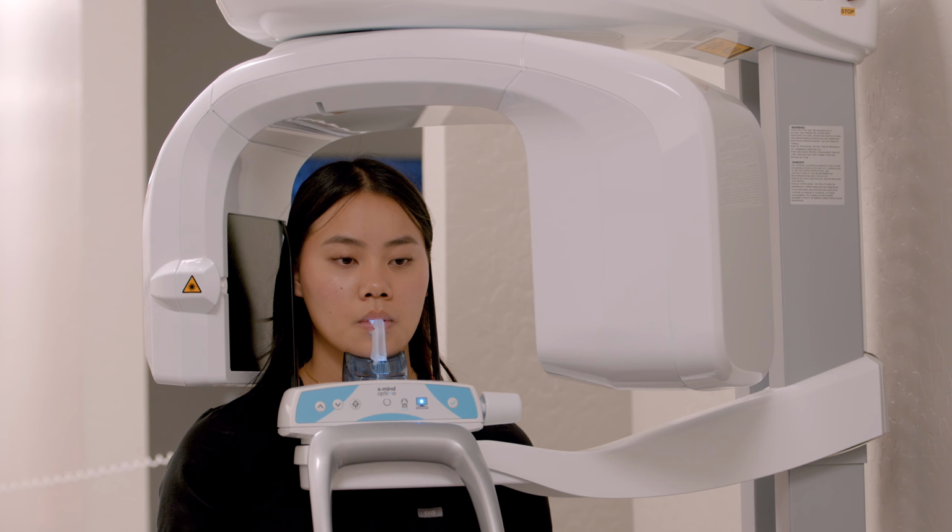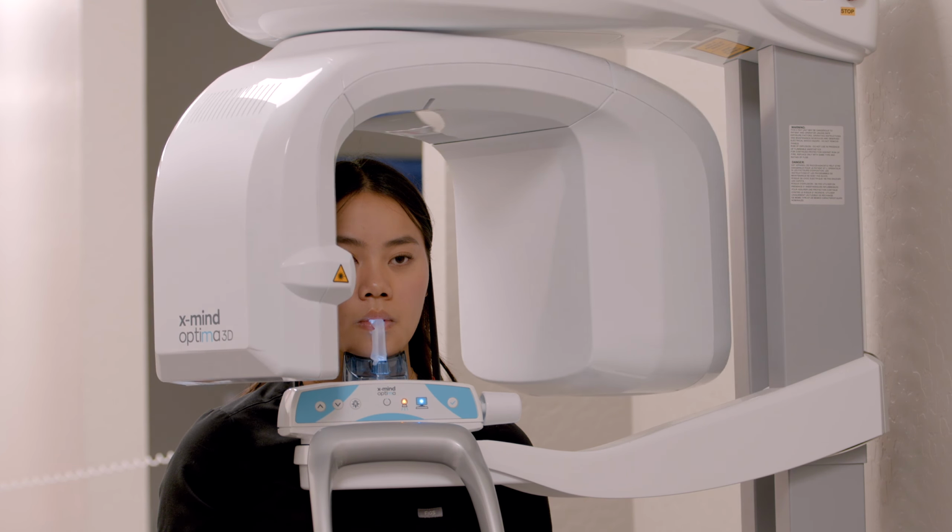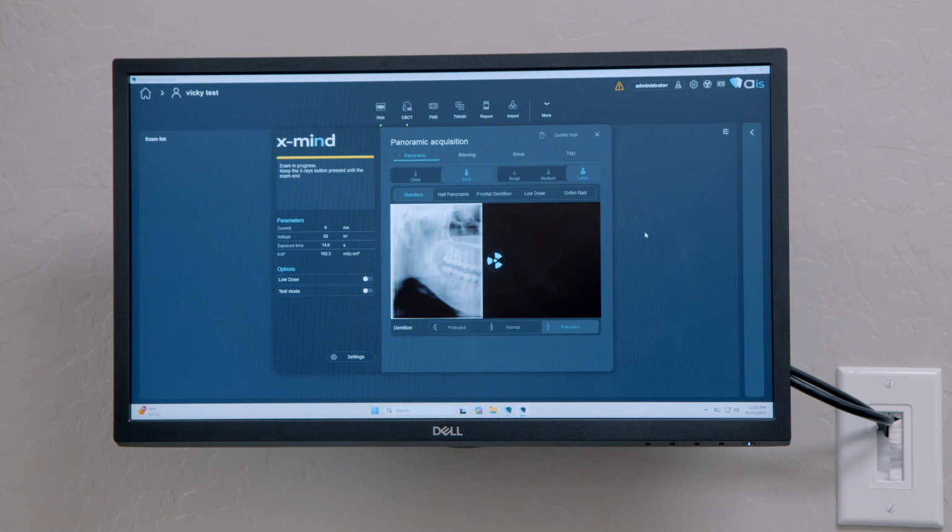All right. There you go. And now the patient can step out.